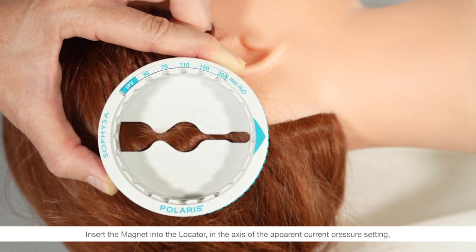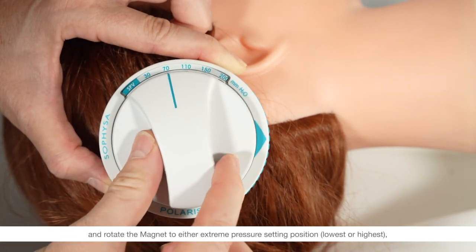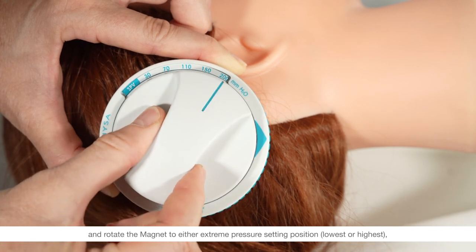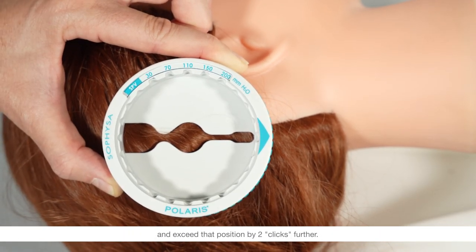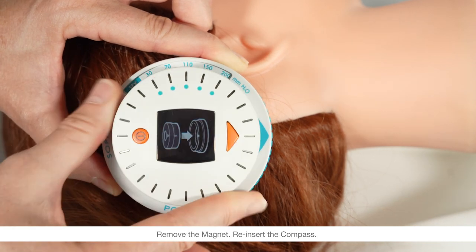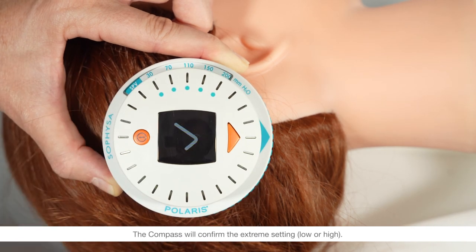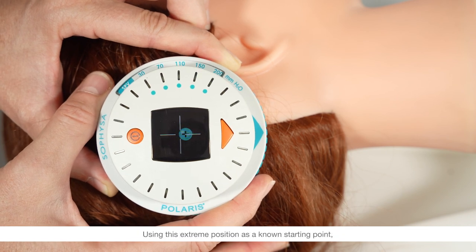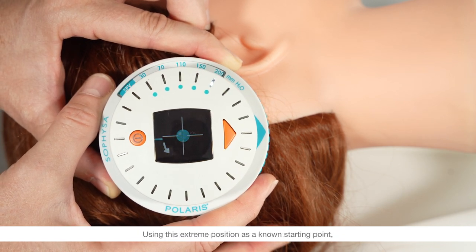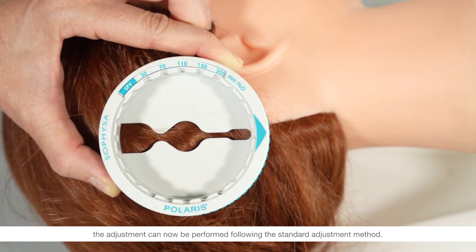Insert the magnet into the locator in the axis of the apparent current pressure setting and rotate the magnet to either extreme pressure setting position, lowest or highest, and exceed that position by two clicks further. Remove the magnet and reinsert the compass. The compass will confirm the extreme setting, low or high. Using this extreme position as a known starting point, the adjustment can now be performed following the standard adjustment method.